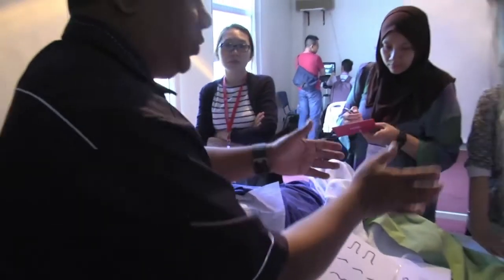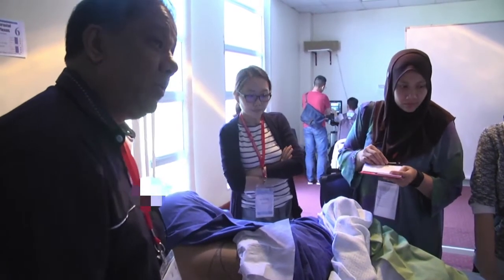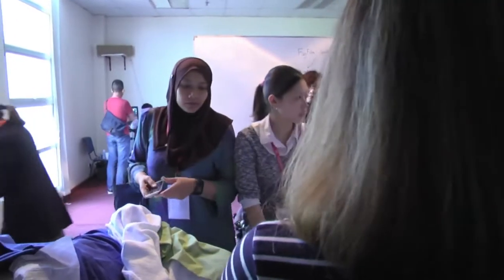Okay, so for now I would just divide ourselves into 2 groups. You should have a little hands-on experience so that you know exactly what we're looking at. Okay, so can you split up into 2? I'll show you that.